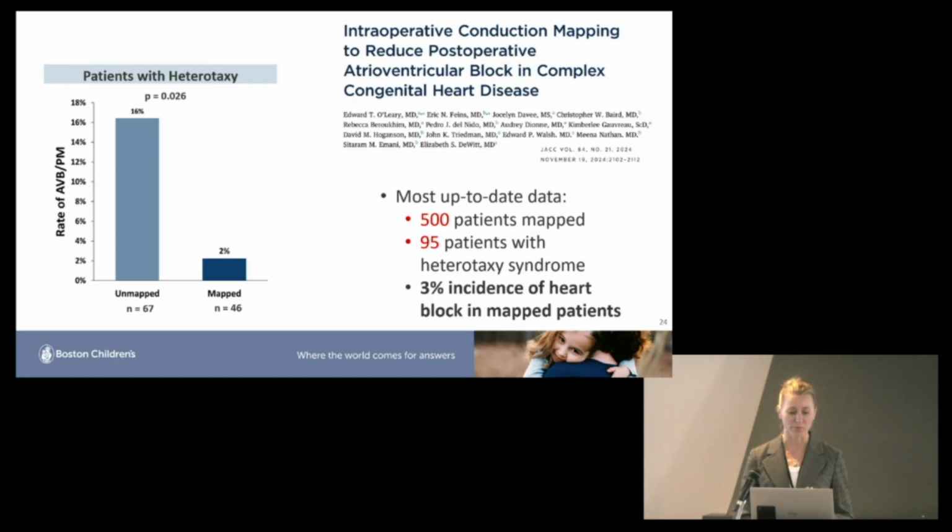And we were really thrilled to find, this is what we had been seeing clinically, that when we compared them to a matched historical cohort of 200 patients who were unmapped, we had reduced our center's incidence of heart block with these complex biventricular repairs in patients with heterotaxy specifically from 16% to 2% with mapping. And we've subsequently mapped another 350 or so. We're about at 500 patients that we've mapped.